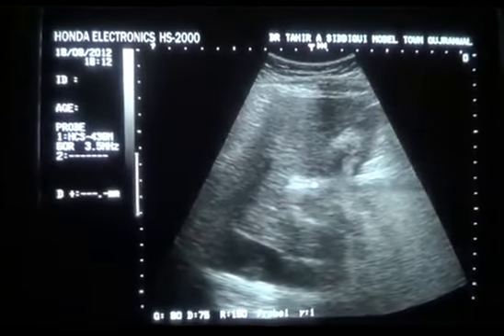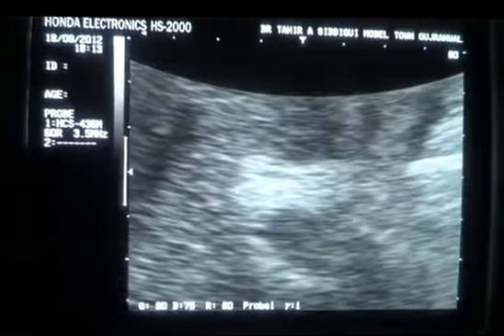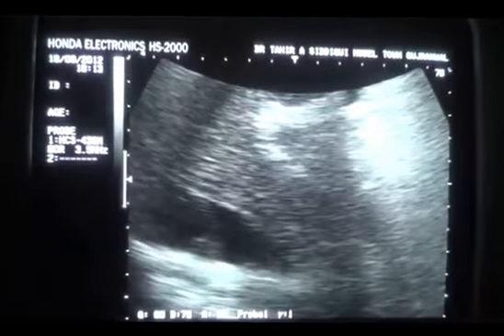You can see that in longitudinal section there is a clot that is so far non-obstructive, because the rest of it is not occupying all of the lumen and not blocking the total IVC.